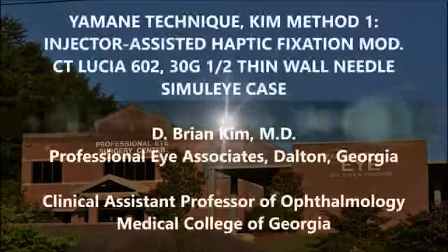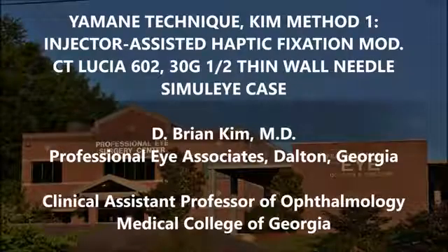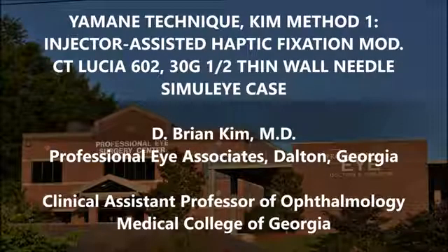Hi, this is Brian Kim. I'm going to share with you the Yamane technique, Kim Method 1, which I call injector-assisted haptic fixation. This is a modification that I developed back in 2017 and published it. I'm going to show this on a SimulEYE and see how easy it is on this model eye.